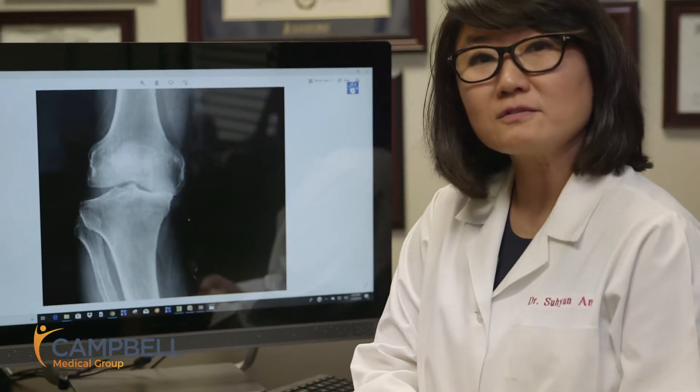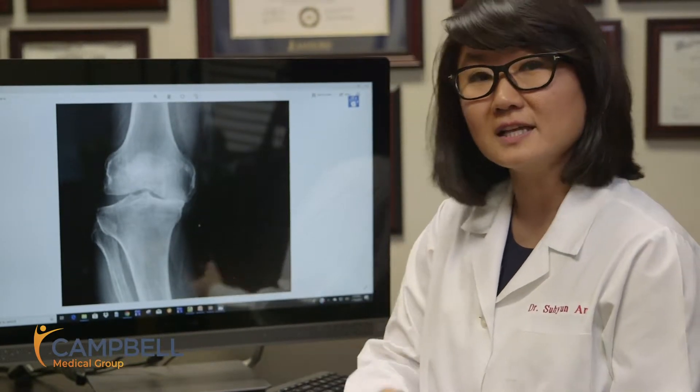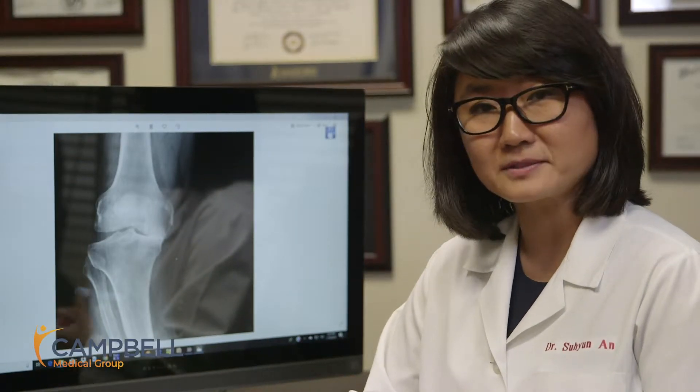I had been looking for a knee rehab or decompressive machine that can open up that space, and today I'm happy to share with you that we're able to do a knee decompression therapy that utilizes a computerized motor. So let's move ahead to the rehab center and let me show you what that looks like.